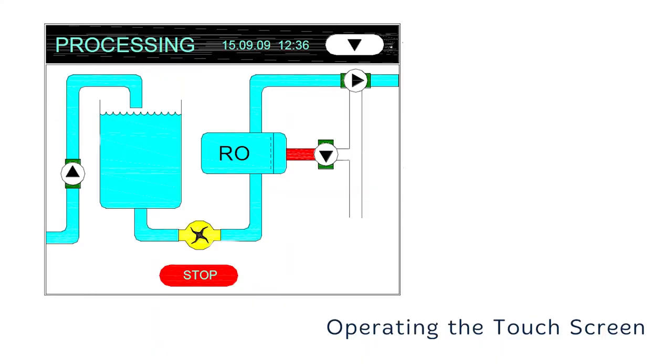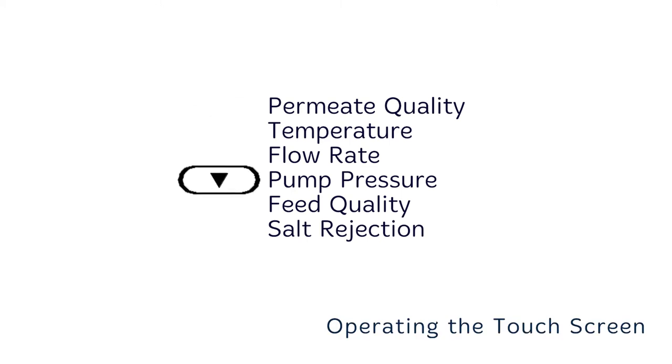To access text about the current process while the mimic screen is displayed, press the function button at the top right hand side of the screen. This will display permeate quality, temperature, flow rate, pump pressure, feed quality, and salt rejection. This information will be displayed on the status bar.